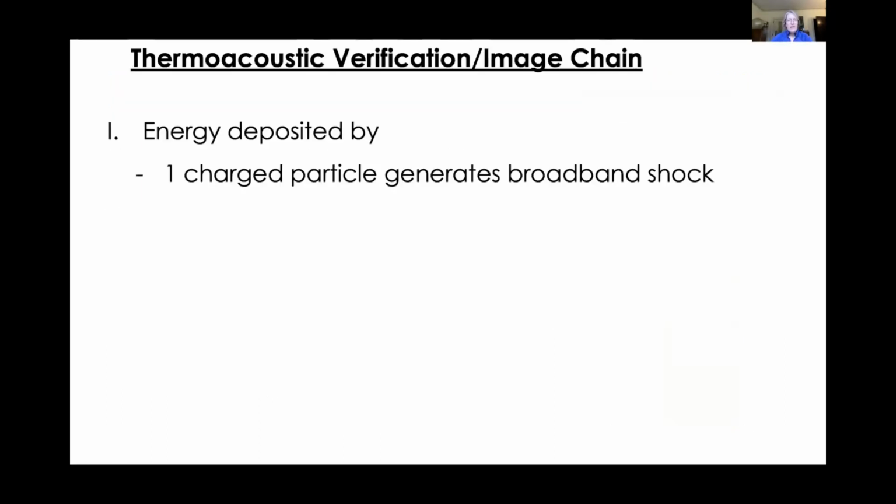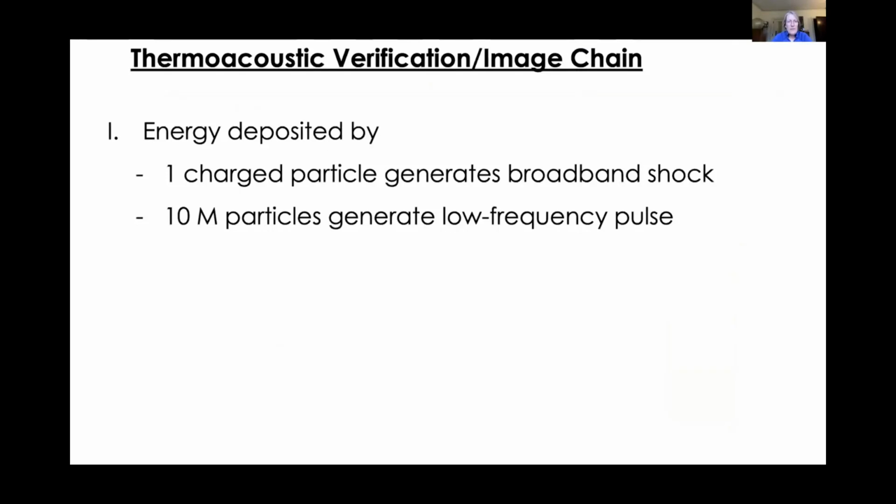Okay, so now let's just talk a little bit about the physics of what's going on. And I'll just talk qualitatively here, because the effects are mind-blowing. When you think about a single proton, with a very tiny diameter, entering a patient at half or 2/3 the speed of light, it generates a shock. When you deposit 10 million of them in a few microseconds, what you get at the end is a low frequency acoustic signal, very low frequency.